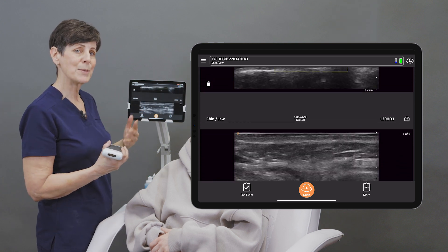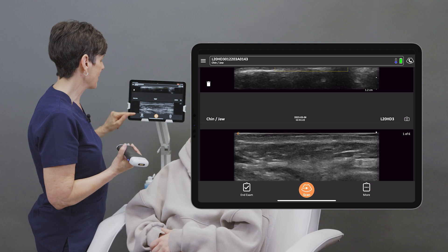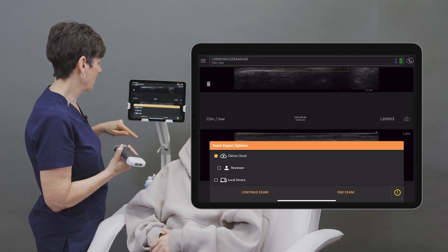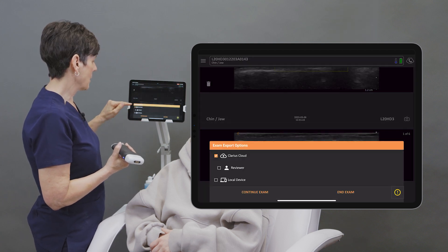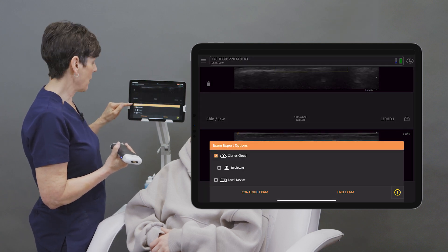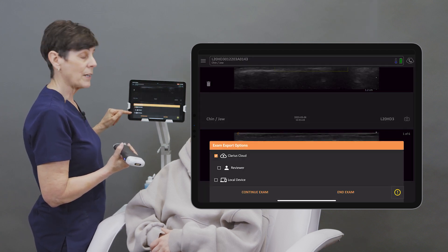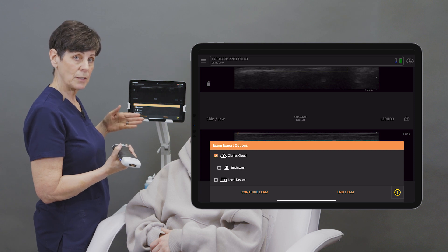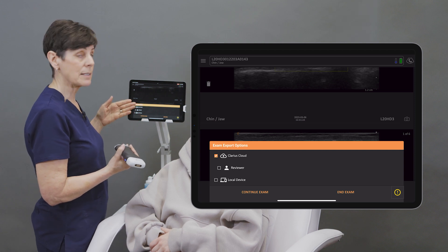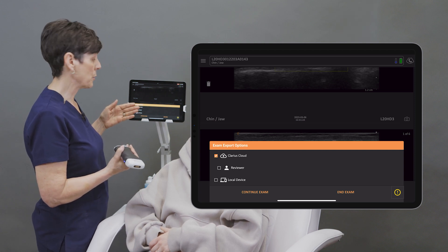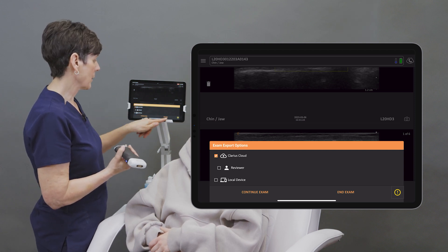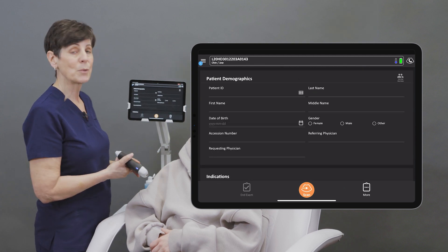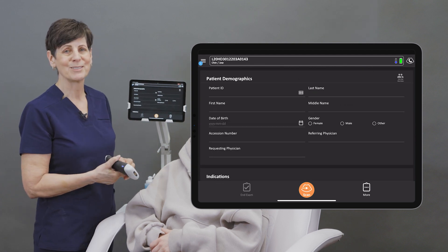At this point, when I'm happy with my images, I can hit end exam, store them to the cloud. If I just want to store them to the local device, I can do that, or I can send to a reviewer. Hit end exam, and we're ready for the next patient.